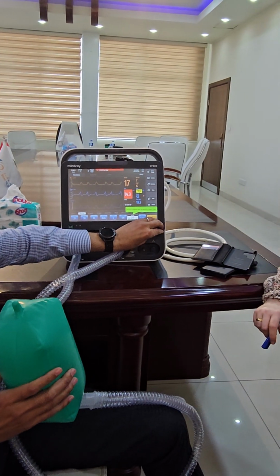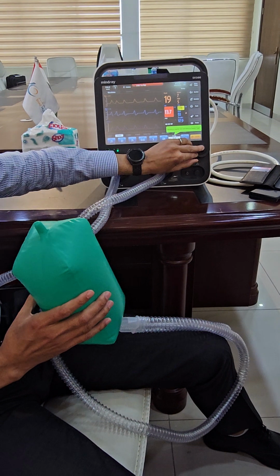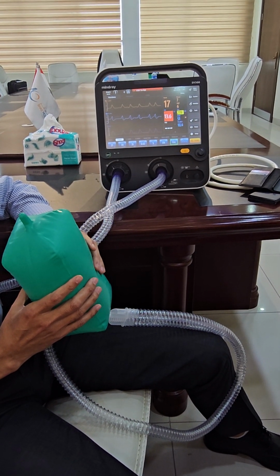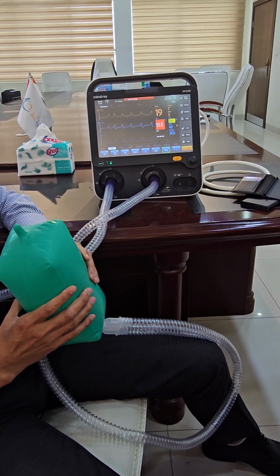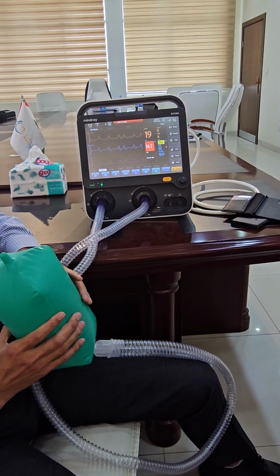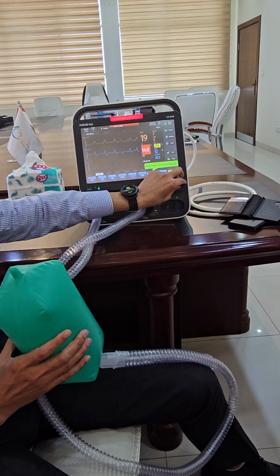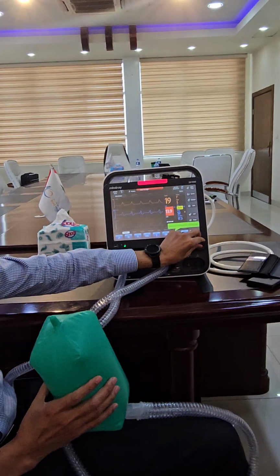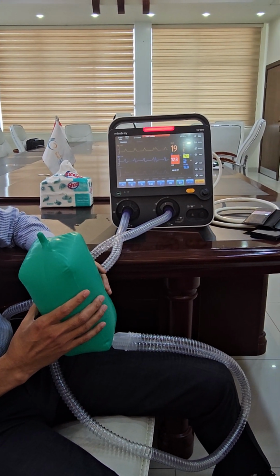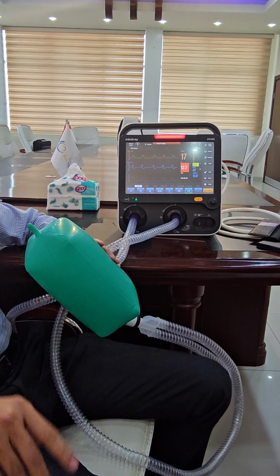Let me decrease it, the flow. Now I will increase it again, make it 3. I can't explain it any other way. We'll explain the trigger later on. Just leave the trigger.